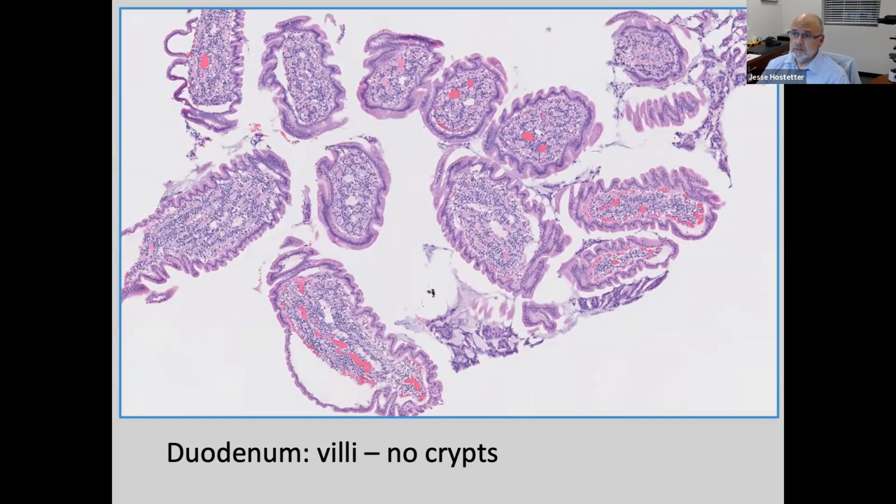Now I look at these, and there can be information you can glean from this. You can see inflammatory cell infiltrates, you can see changes in the epithelium, and sometimes you look out and you can see lacteal changes as well. So I don't discount it, I look at it, but there are limitations for what I can tell from this biopsy.